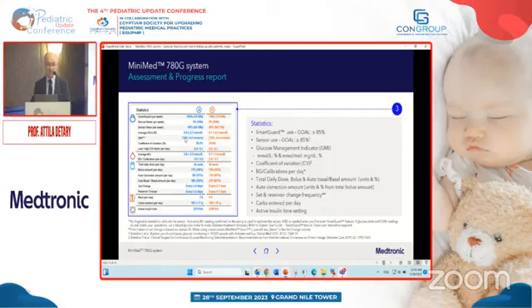And what is also very important is the GMI, the glucose management indicator. This is a relatively new parameter. It's the estimated hemoglobin A1C. Because we have a lot of data points, the sensor measures every 5 minutes. So during a day, you collect 288 data points. And if you have a two-week period, then it's a lot of data. Based on this, you can estimate the HbA1c. And to differentiate between the estimated, they started using this glucose management indicator, or GMI. So GMI, in fact, is the hemoglobin A1C during this two-week period you have selected.